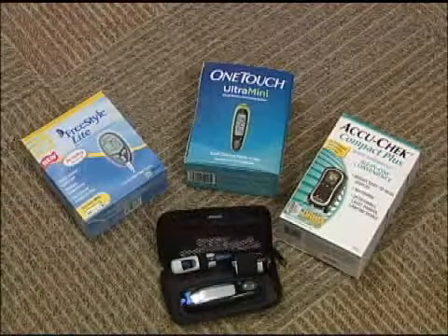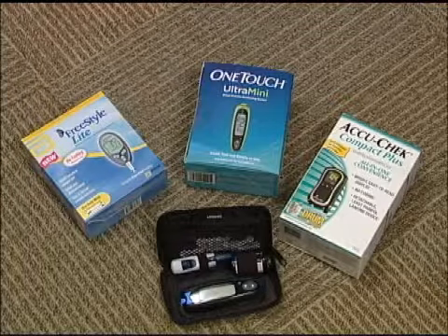First, gather your supplies. You should have your meter, your test strips, and your lancet. Before you start testing and after you've gathered your supplies, make sure you wash your hands with soap and water. Lotions we wear and food we touch have sugar in them and can give you false readings, so you want to make sure your hands are clean and dry before you test.